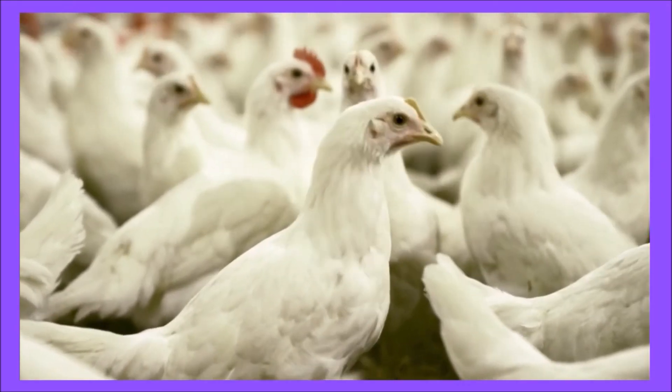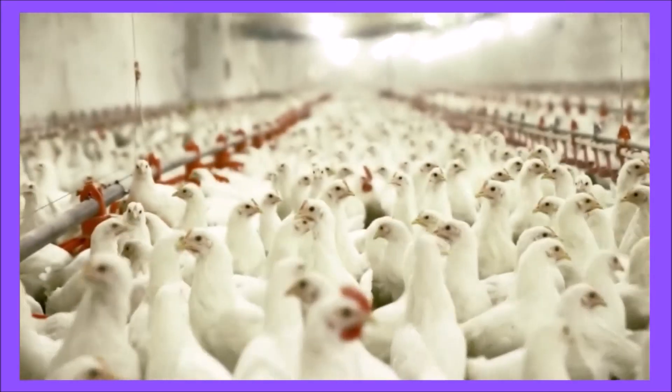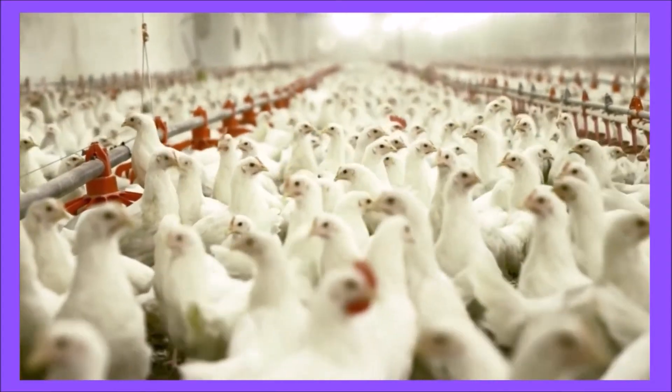The following footage shows a veterinarian at Griffin Farms taking blood samples from the brachial vein of several chickens. As mentioned before, viewers' discretion is advised.